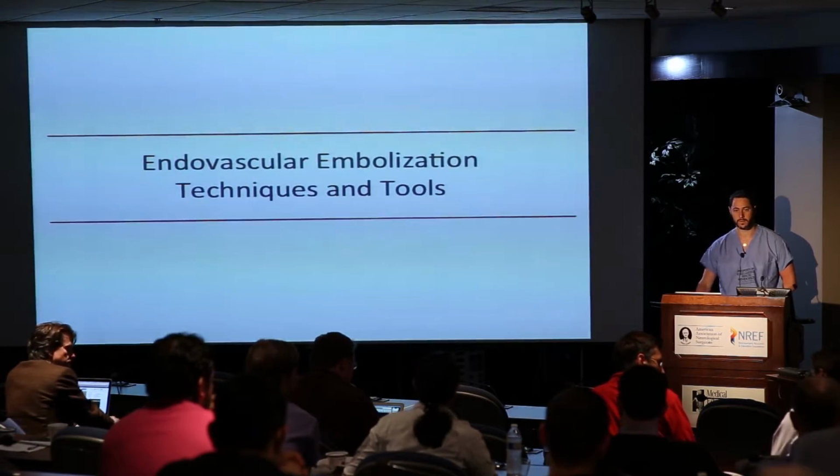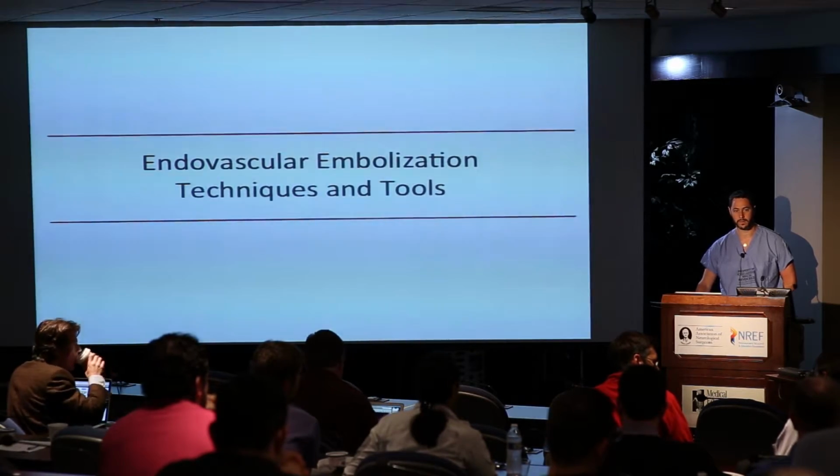Yeah, I would totally agree. I mean, unless you get all the arterial supply taken care of, that AVM is still a living, breathing monster that can erupt. And I would just say going in transvenous just doesn't make any sense.